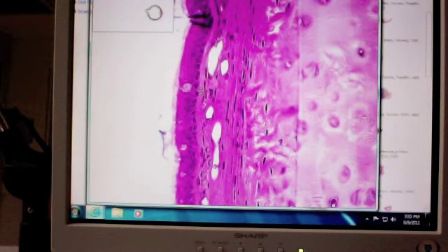So we really can't tell the difference with this kind of mag. At this mag you can't, so basement membrane. And under just about any light microscope, you cannot tell the two different layers apart from each other. So if you're looking at a light microscope image, basement membrane is correct. I could ask you, this structure is divided into two layers. Name the layers. Okay. And that will be basal lamina and reticular lamina.